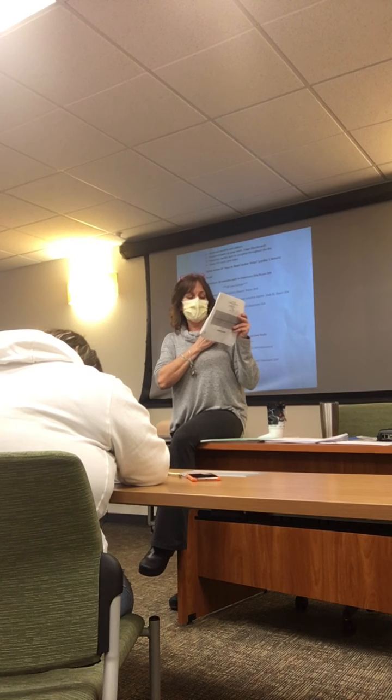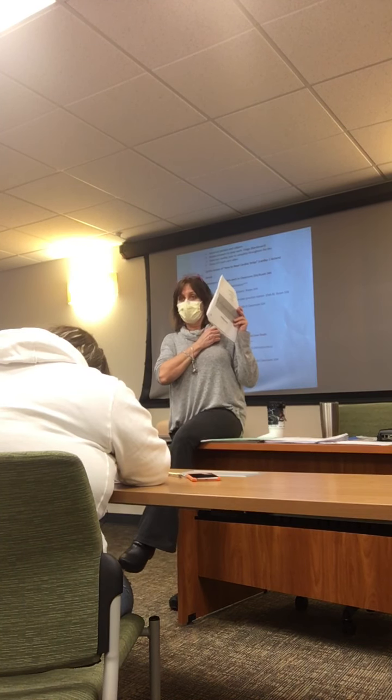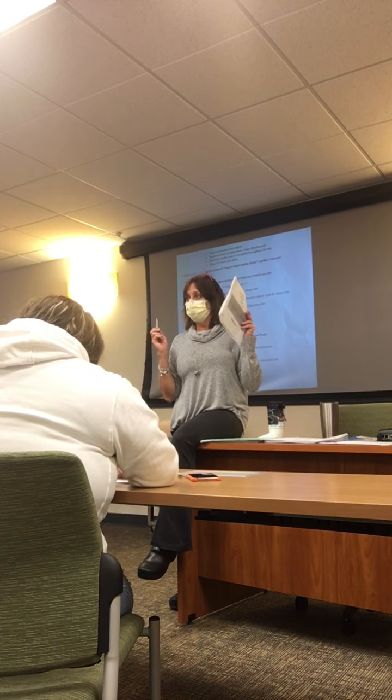And how many little boxes? So I got 4 little boxes. So my PR interval is 0.16. Is that normal? Yes.